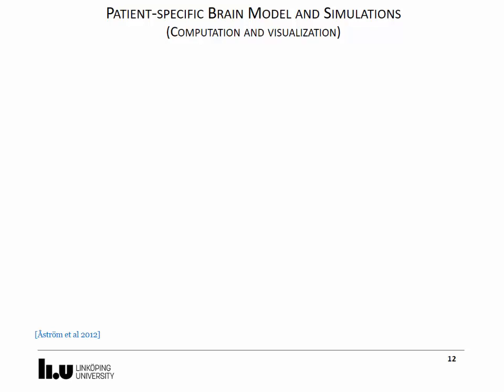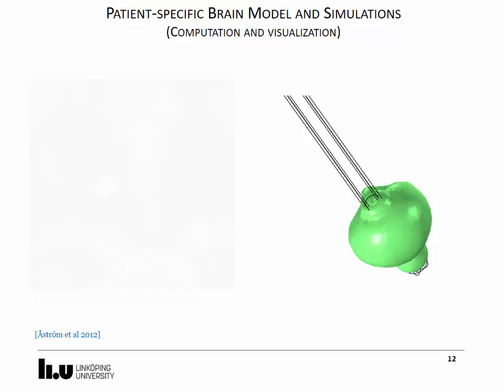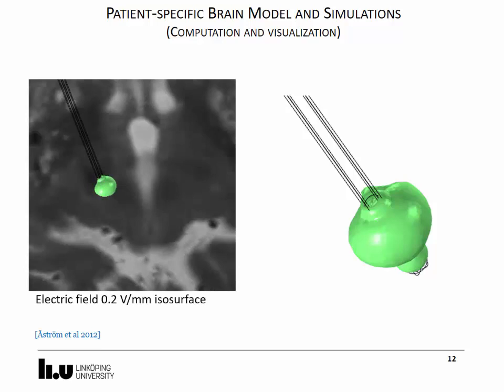Once the computation is run, the electric field may be visualized in different ways, as a surface plot as shown in the axial cut plane to the left or with isovoltage contours and surfaces. Our group uses a fixed isolevel of 0.2 volts per mm.